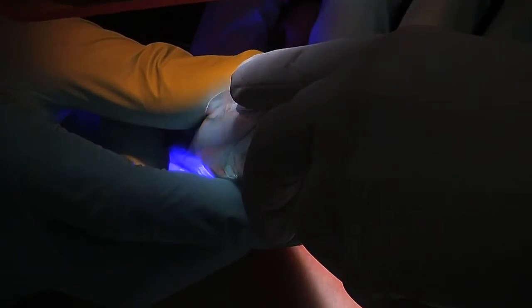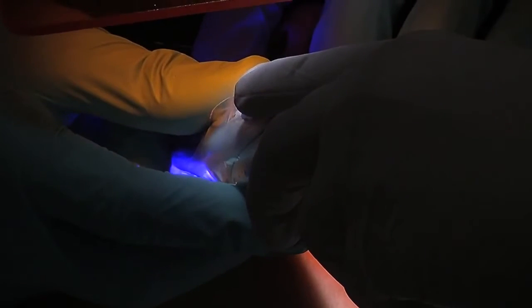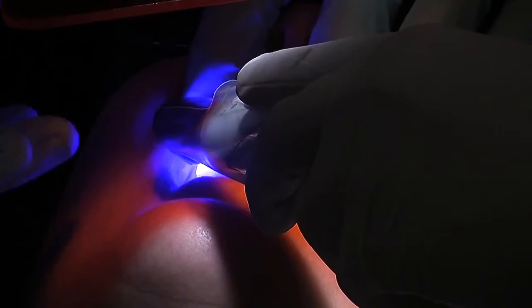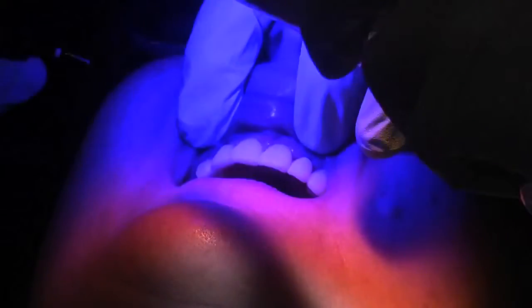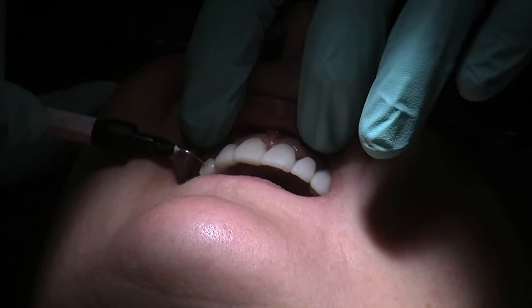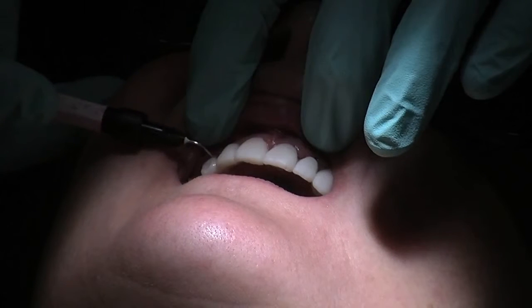So the other great thing about Luxaflow is you can make shape changes. You can add to the buccal fullness, apart from just filling in the voids and things that need attention, they're obvious. And this will obviously help improve the trial smile for the patient and yourself to diagnose. That's fine, take it out. Then I'm just going to add a little bit here like this, like a flowing movement. I'm actually just bringing out the whole of the labial contour.